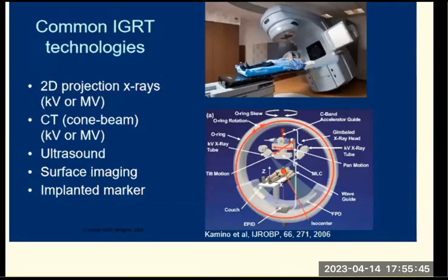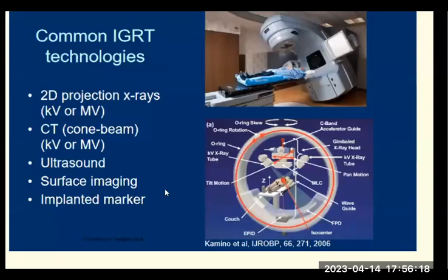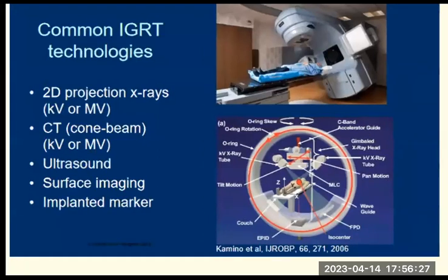As we say, in image guided radiation therapy, I acquire an image, see the status of the tumor, and accordingly the radiation therapy will be provided. There will be fiducial markings. Around the image you can see the hand drawn structure diagrams here. We can have fiducial marks, or an implanted marker inside the patient's body where the tumor is. Through that we can find out the status of the treatment.